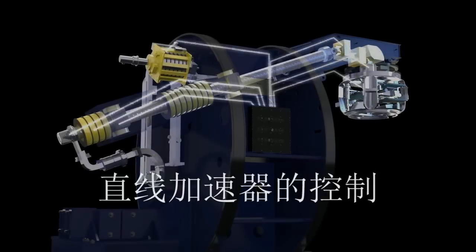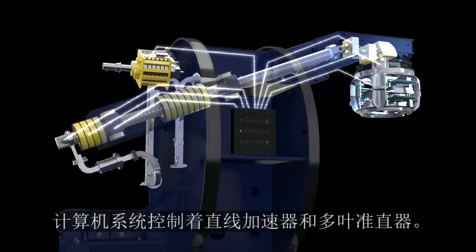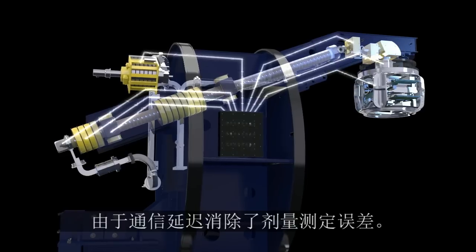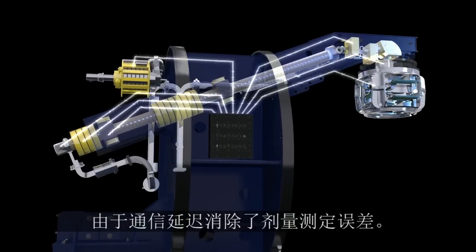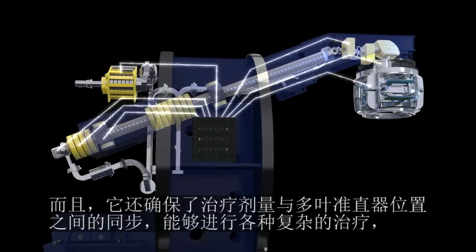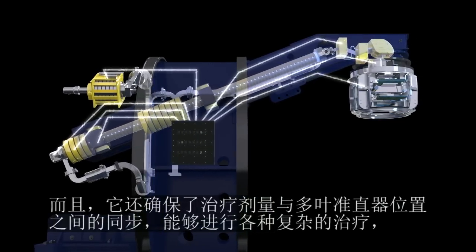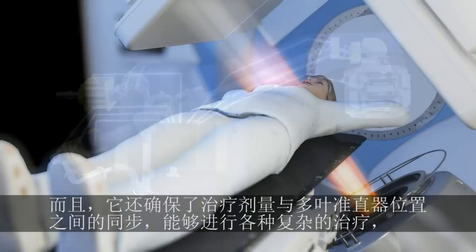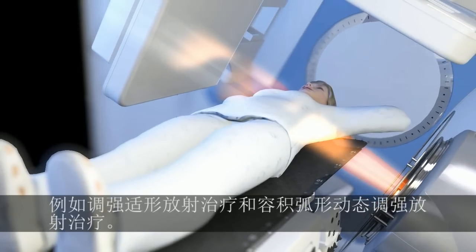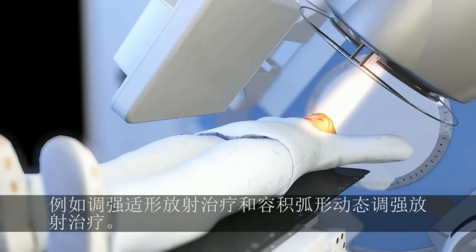Linac control. One computer system controls both the linac and the multi-leaf collimator. This eliminates dosimetric errors due to communication delays. It also ensures synchronization between the delivered dose and the multi-leaf collimator position, allowing complex deliveries such as intensity modulated radiation therapy and volumetric modulated arc therapy.